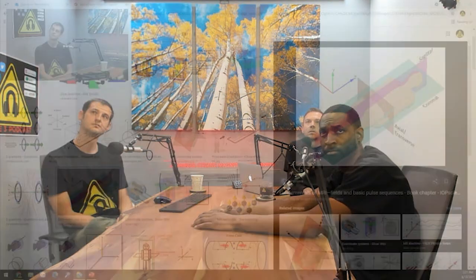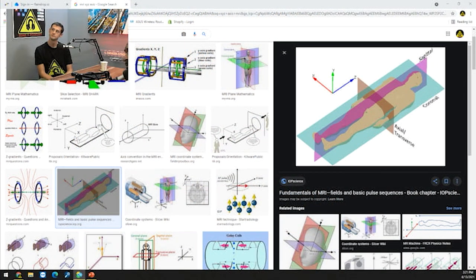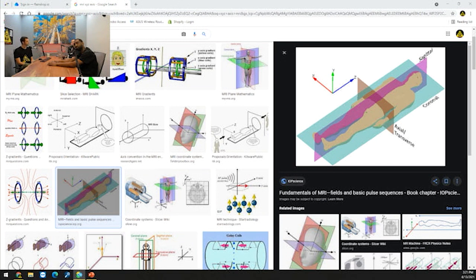But like I said, we scan in 3D, so just to give you a different idea of what it is that we're looking at: XYZ coordinates. That's an image we could use. Exactly. And we actually use these coordinates to plot where in the magnet or the bore the patient is positioned. So if they move literally the depth of a dime, well, we're scanning in slices, sometimes less than that.